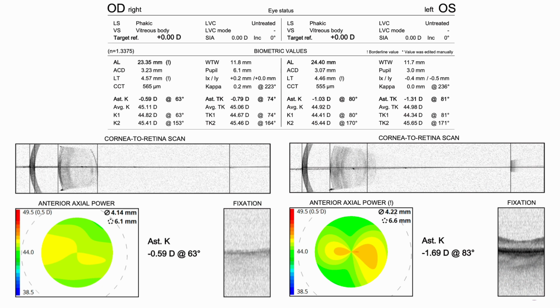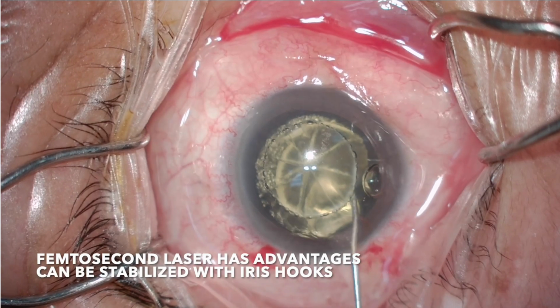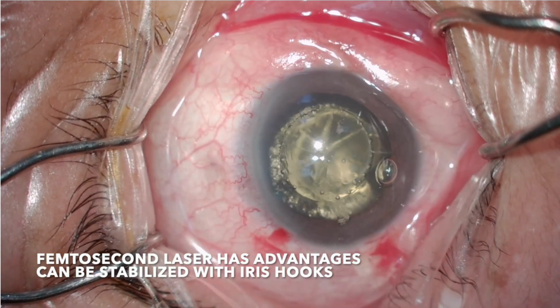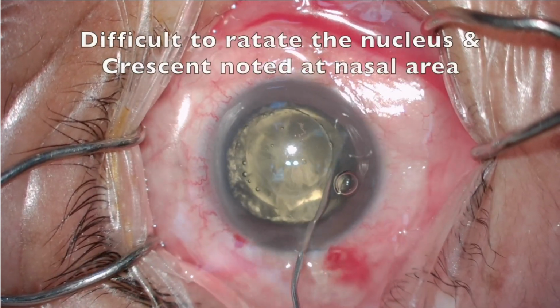The anterior chamber depth is 3.23 mm. It's deeper than his left eye. There is no lens tilting at anterior segment OCT. Next is his cataract surgery video. Femtosecond laser has an advantage in zonular dialysis cases. The anterior capsulotomy can be as central as possible with a 5 mm size. It can be stabilized with iris hooks or capsular hooks.